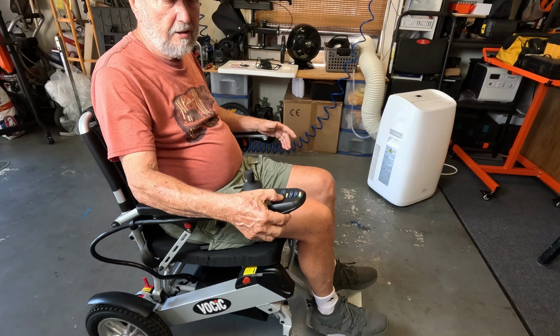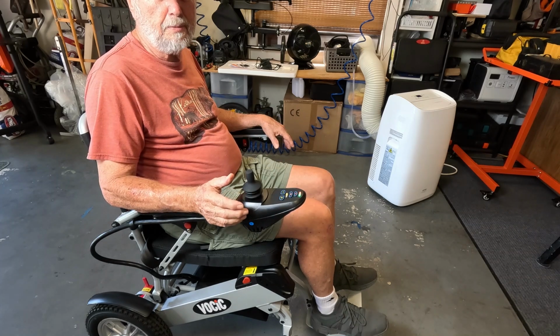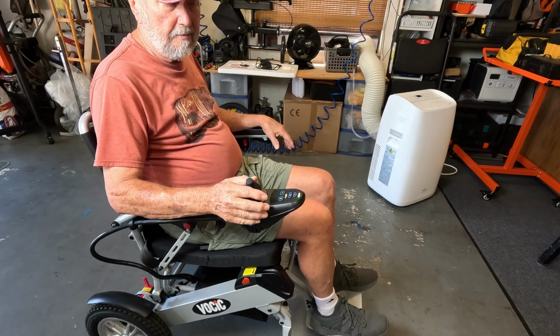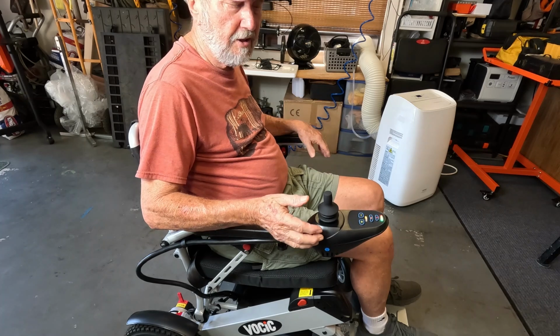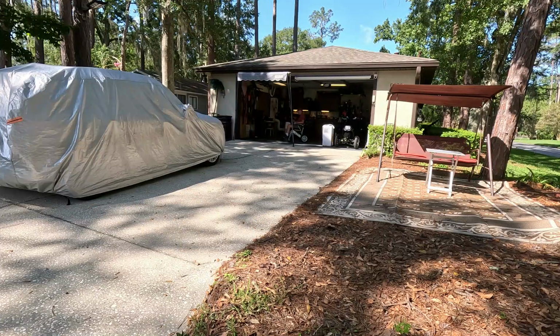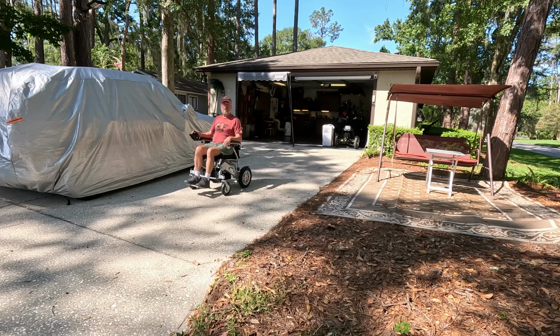And then I could go in faster speed. We'll go out into the road and do a fast speed and let you see that. But you have a horn right here. Let's see, so you can see it. If somebody gets in your way at the grocery store, you can alert them that you're back there and you need to get someplace. Full speed.